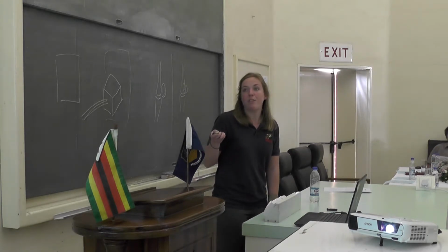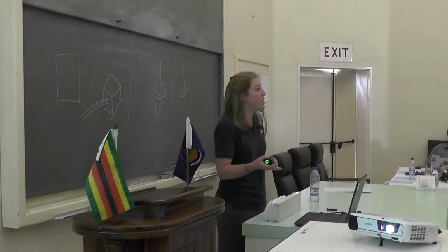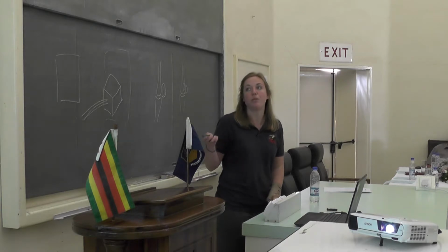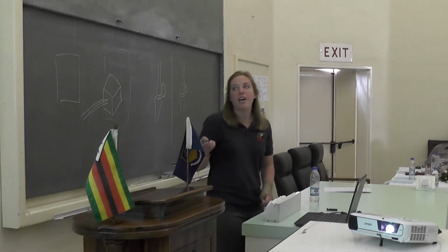aiming for where the level of P3 is, which is normally 1 or 2 centimeters down. And this depends very much on the conformation of your horse or of your donkey. It depends on how long its hoof is, so that's why you need to imagine the anatomy inside the hoof capsule. But you center just below the coronary band, and then you align with the heel bulbs just to try to get a true lateral as much as possible, and you should have the cassette on the floor, vertical and perpendicular to the floor, and that's how you project it.